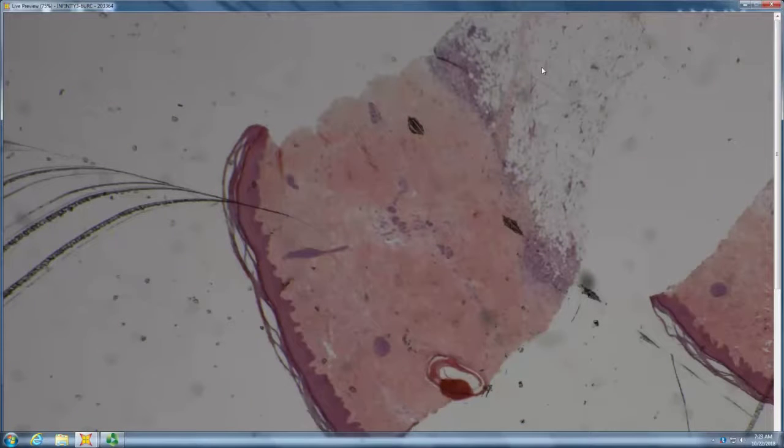Punch biopsy, square shape, sclerotic dermis, and in the deep fat there is some inflammation, and also the adnexa are trapped. Morphea again. So morphea again, very well done. It is a very rectangular or square punch. The adnexal structures have no periadnexal fat, which would be normal on trunk and proximal extremity, right? They usually sit surrounded by fat. Here, the collagen goes straight up to the sides of the adnexal structures, so-called adnexal trapping. You have nodular lymphoid infiltrates at the dermal subcutaneous junction, so very good for morphea again. Very good.